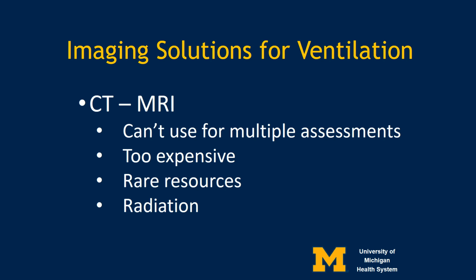So imaging solutions for ventilation exist, although the present solutions are problematic. CT and MRI are possible candidates for monitoring ventilation. However, they really can't be used for multiple assessments. They are too expensive, they are rare resources, and the radiation dose issues with CT are problematic.